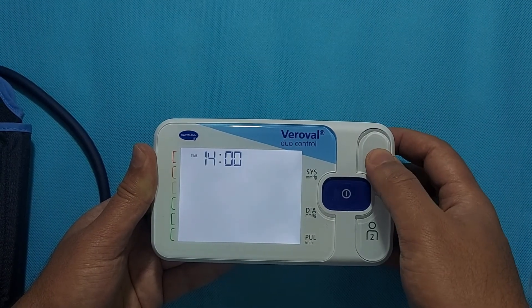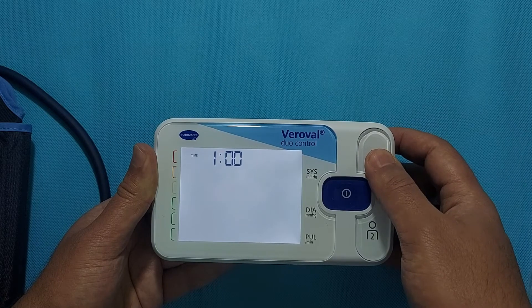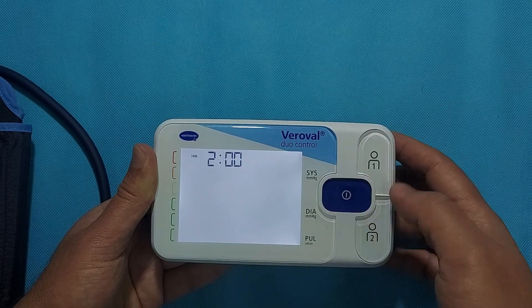You can also modify the month using the same technique. Then, using the same method, set the year in the device.